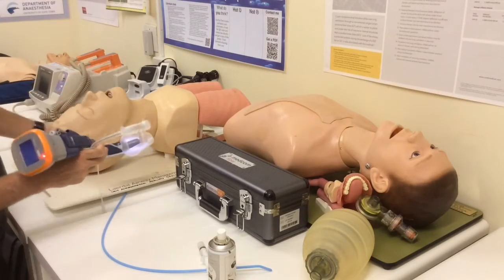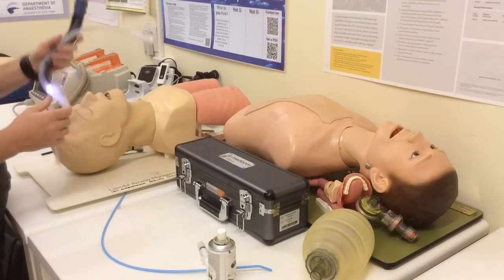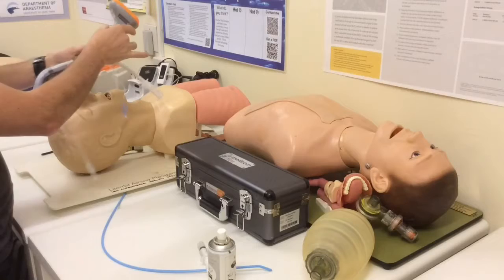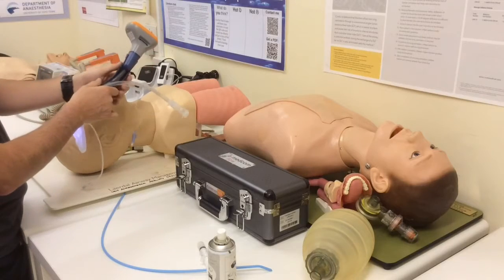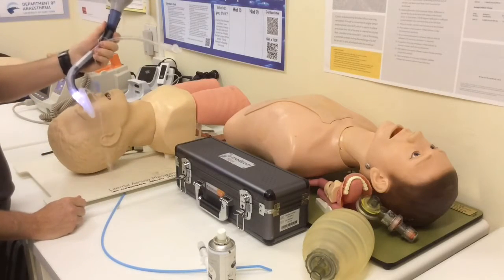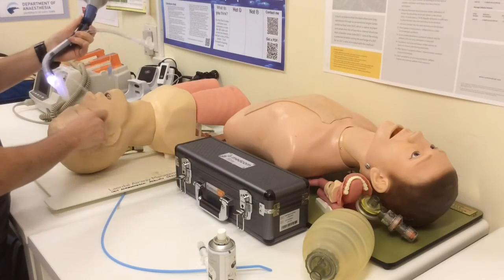The manner of using this is quite simple. Make sure my patient is either completely obtunded or anesthetized, and I put it in just like any other supraglottic airway. Now you'll see, it is quite long and it is quite bulky. What you need to resist is the urge to hold it up here, because sometimes you can then disconnect the camera and it takes a couple of seconds to reconnect. So hold it nice and low down, like you would hold a laryngoscope. Remember, this is kind of a hybrid between a supraglottic and a laryngoscope.